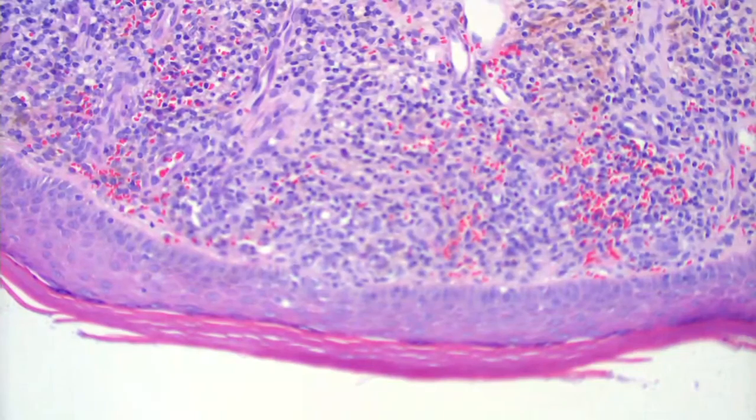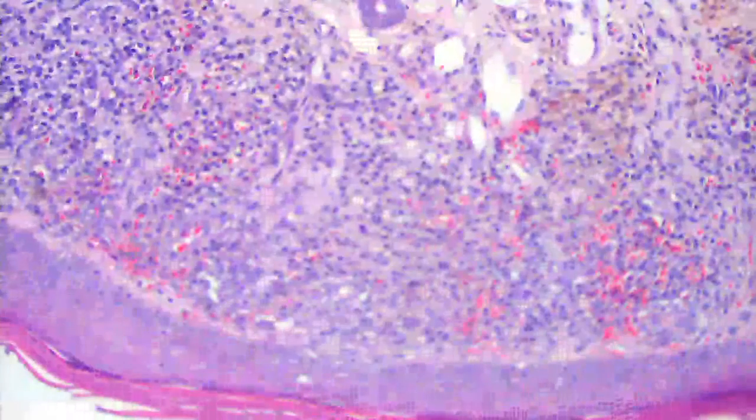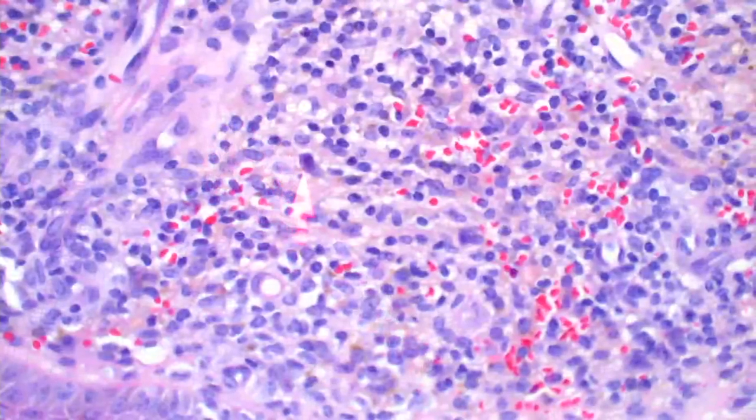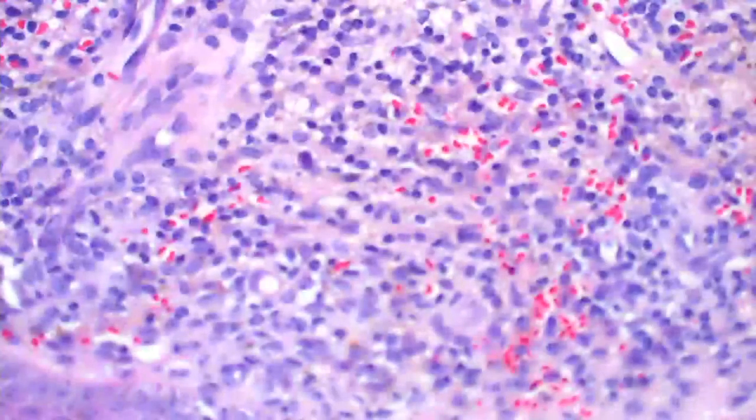And why is it called lichen aureus? What does aureus mean? Because it's golden. Golden, yes, good. Looking at legs, you know. And the gold comes from, it's not really gold, it's hemosiderin, right? Now there's a plasma cell here. Should we work the patient up for syphilis? No, you can see plasma cells in any kind of chronic inflammation, you get a few plasma cells here and there, so no, we're not going to work this patient up for syphilis.